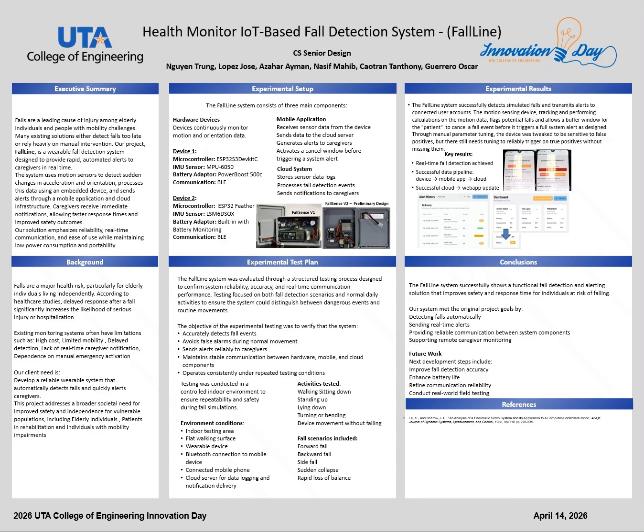Inspiration for this senior design project was on health devices. Falls are the leading cause of injuries amongst elderly individuals and people with bodily motion challenges. Many times, families find a fallen relative after a considerable amount of time, which drew inspiration for us on creating a device that would help work in a similar function as Life Alert.